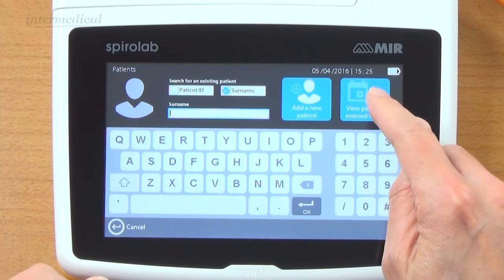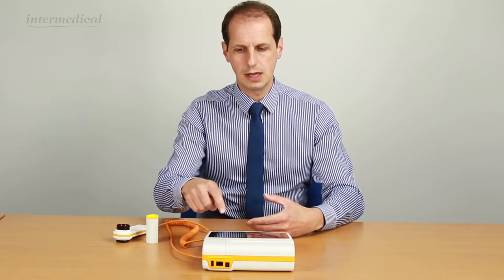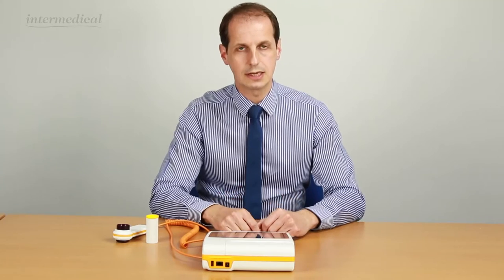We can add a new patient, and what you can do is pre-enter your clinic for today. So if you've got five spirometry patients coming in, you can pre-enter them, save them into the memory, and then click on view patients for today. That would bring a list up for you so you haven't got to sit there and enter their details in front of them.